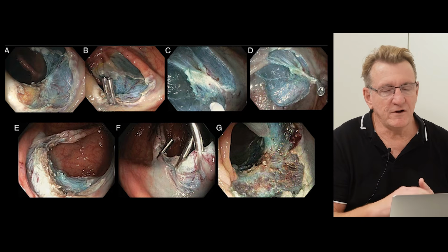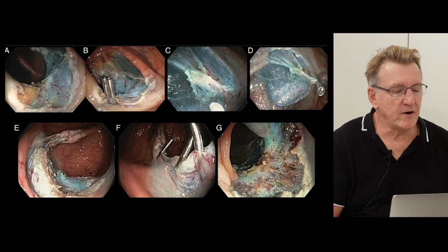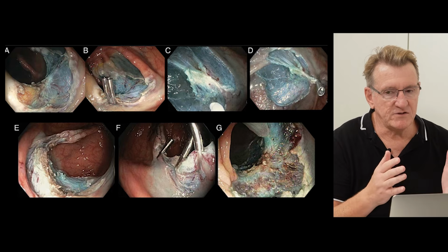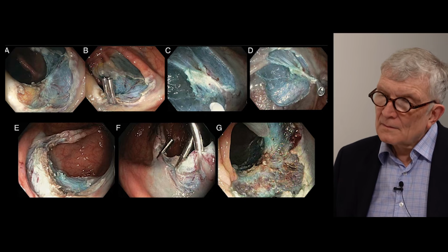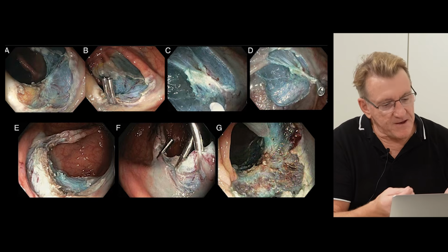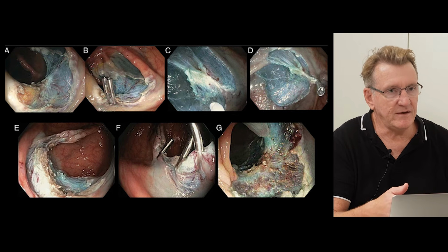So 50% of lesions are flat granular lesions in general, and you normally get a beautiful type 0 resection defect. But some lesions exhibit submucosal fibrosis due to their inherent biology, so they're generally flat, non-granular lesions, often found in the transverse colon. They may have pseudodepression, and they often have quite a bit of submucosal fibrosis. But the worst example is always seen with previous attempts. You see a lot of scarring.